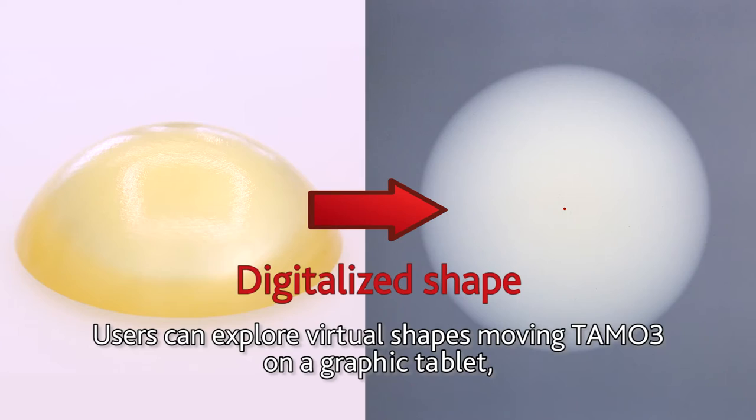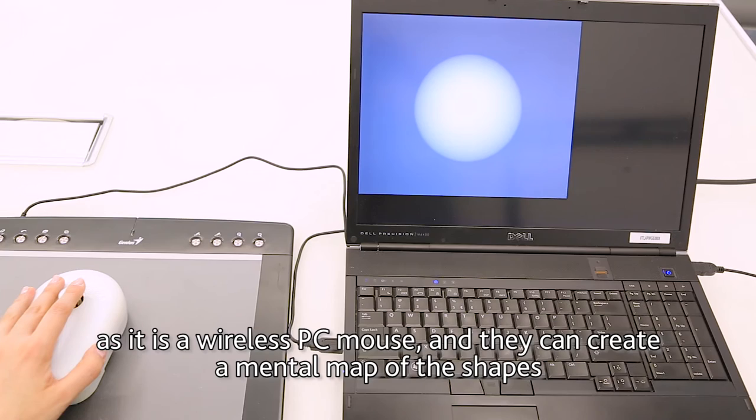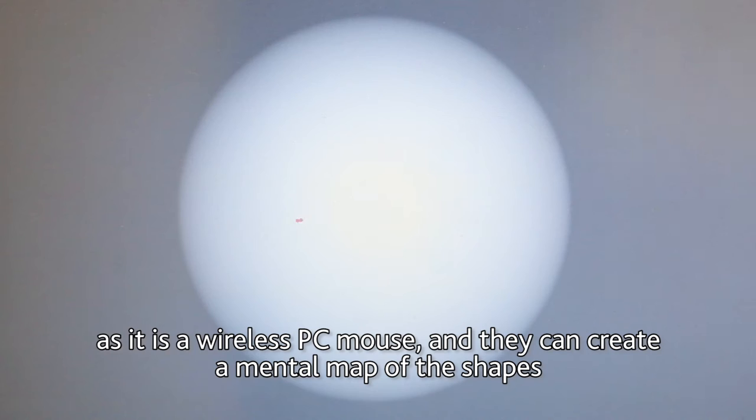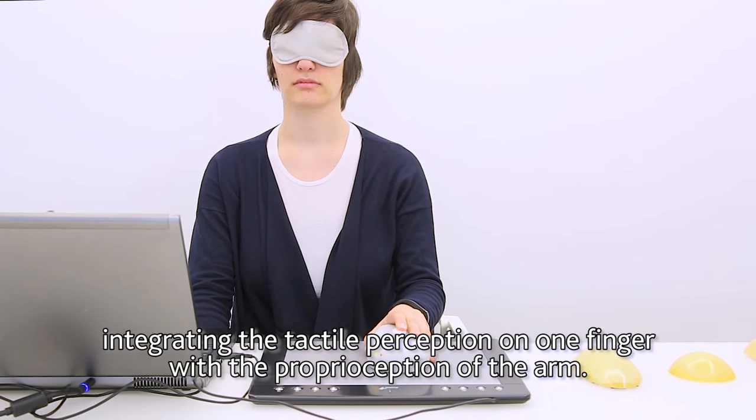Users can explore virtual shapes moving TAMO3 on a graphic tablet, as it is a wireless PC mouse, and they can create a mental map of the shapes integrating the tactile perception on one finger with the proprioception of the arm.